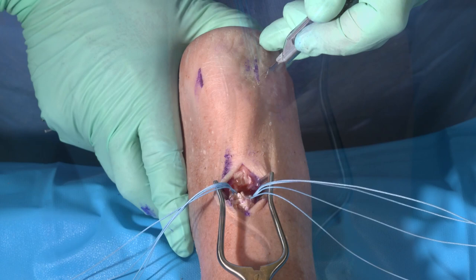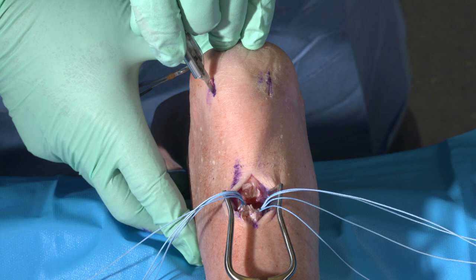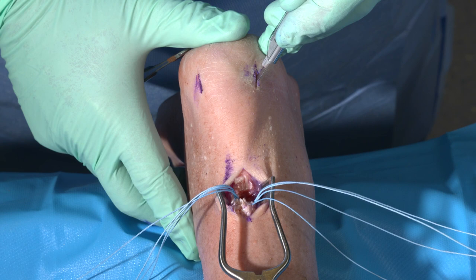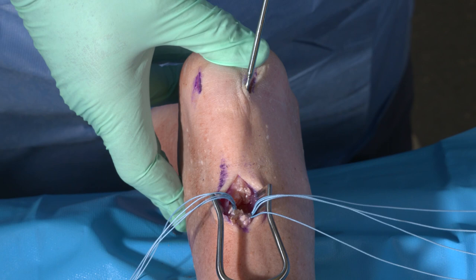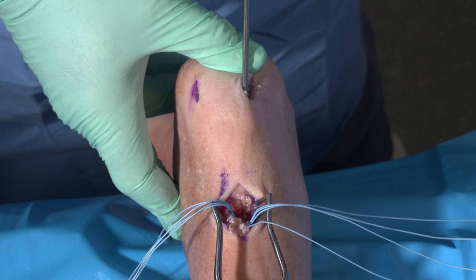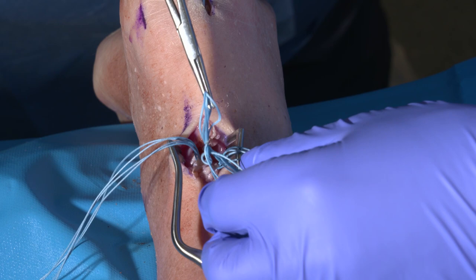With the proximal end secure in two safe zones, I will make some stab incisions to the level of the posterior aspect of the heel. I like to make my incision just lateral to the insertion of the Achilles tendon directly down to bone. The incisions are approximately a centimeter and a half in length. The instrument is inserted into the wound and delivered into the mid-substance of the Achilles tendon, allowed to extend proximally into the wound, and should be exiting in the midpoint of the Achilles tendon.